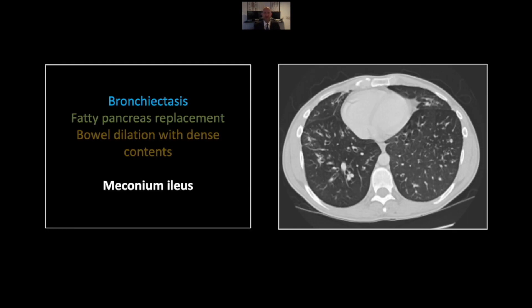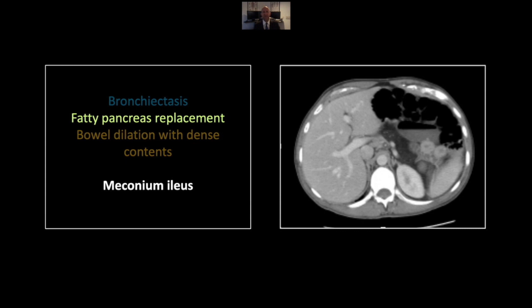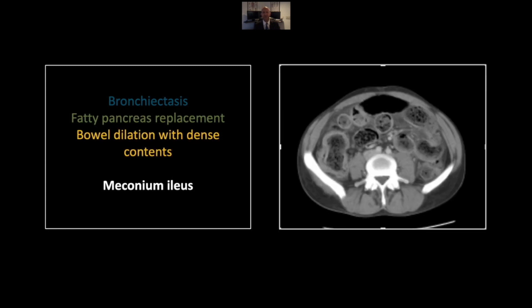Our next case is a meconium ileus in a cystic fibrosis patient. In the lung bases you can see bronchiectasis. A great rule is you should not see the lumen of bronchi in the peripheral third of any lung lobe — here they're obviously present right out to the periphery, along with wall thickening suggestive of chronic bronchiectasis. In the abdomen, the tell-tale finding of cystic fibrosis is this extensive fatty infiltration of the pancreas with essentially no residual pancreatic parenchyma identifiable. Another complication is meconium ileus, with very dense inspissated stool throughout both the colon and small bowel.